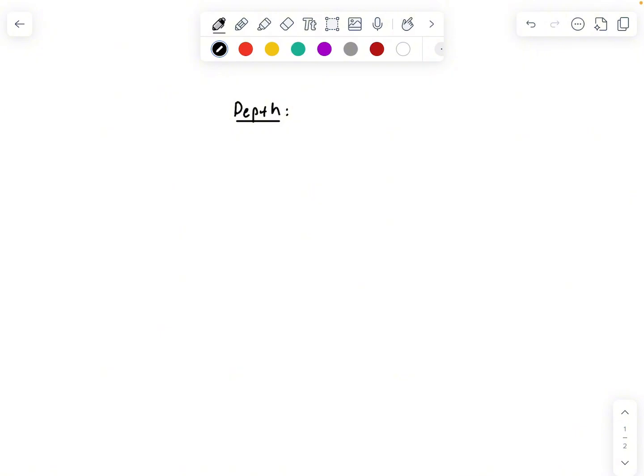Here's one component that I think is important when you're intubating a pediatric patient. And that is, how far do I insert the tube? And there's also a very simple formula for this. And it's simply 3 times the tube size equals the depth of insertion. All right, and there you have it. 3 times tube size equals depth of insertion. Very briefly, let's go ahead and do a quick example.